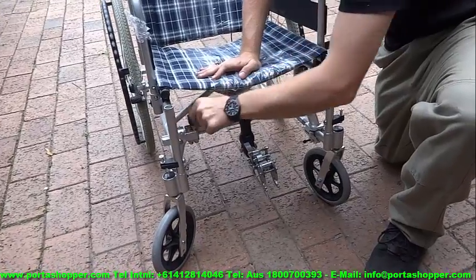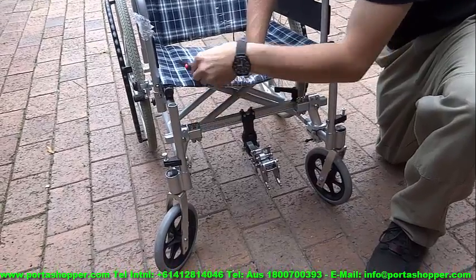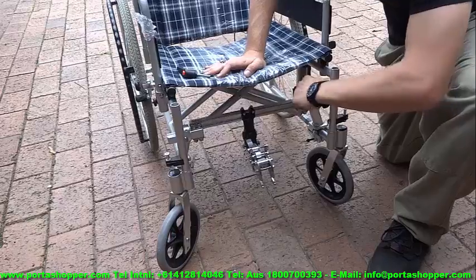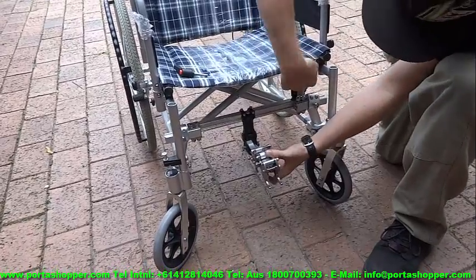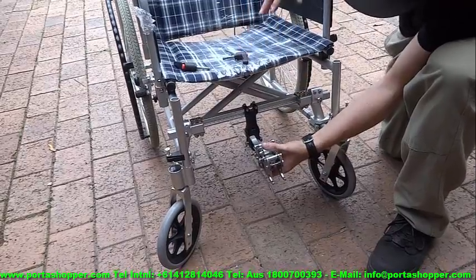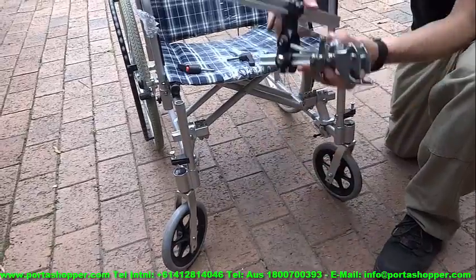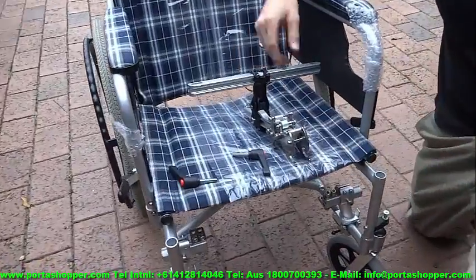Also remember that when you want to fold up your manual wheelchair, all you need to do is remove the tow hook crossbar by simply undoing the two safety bolts keeping the crossbar locked into the frame clamps. Just leave the frame clamps attached to your wheelchair and fold it up, and it will not interfere with the folding mechanism at all. Once practiced, this literally takes less than a minute.